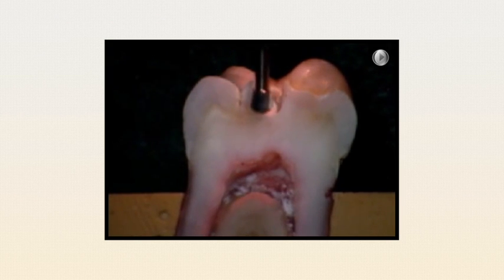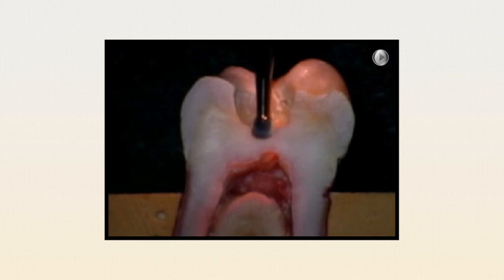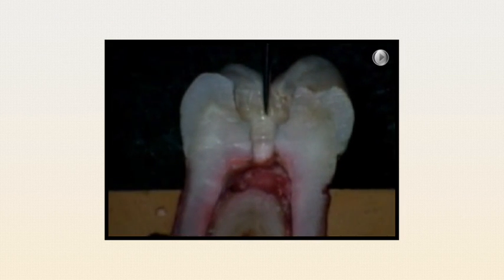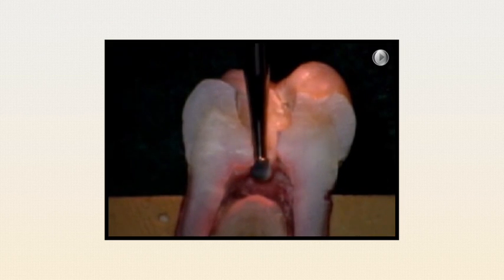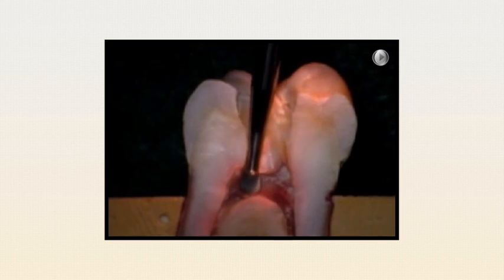Notice through the penetration phase, we're going for the highest point of the actual ceiling of the canal chamber. Once that's reached, you see that characteristic drop into the chamber, and we're trying to locate the main orifices and the main entry into the canal spaces. From that stage, we want to enlarge with brushstrokes coronally, getting rid of any overhanging dentinal chamber ceiling so that all organic and inorganic debris can be removed.